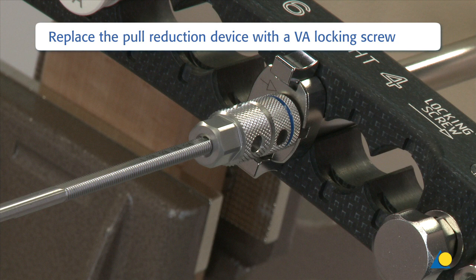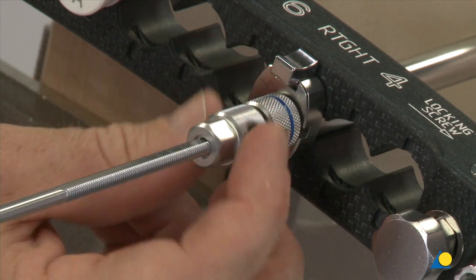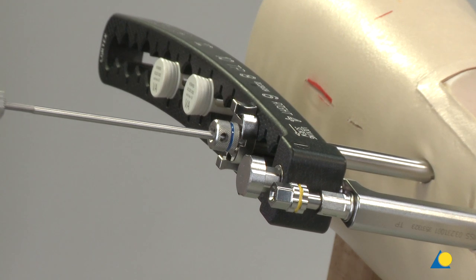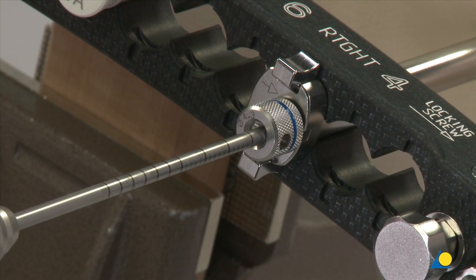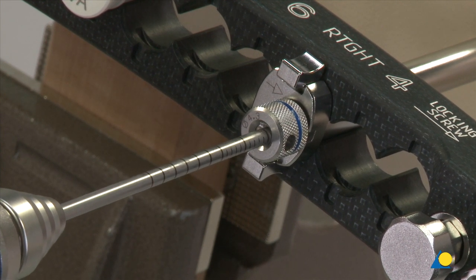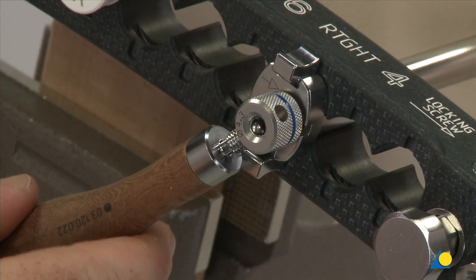To replace the pull reduction device with a variable angle locking screw, first loosen the nut on the device with the combination wrench and then by hand. Remove the device with the power tool. Prepare the screw hole with the 4.3 mm drill bit. Read the screw length off the calibrations on the drill bit. Release the drill guide with the handle and remove it.